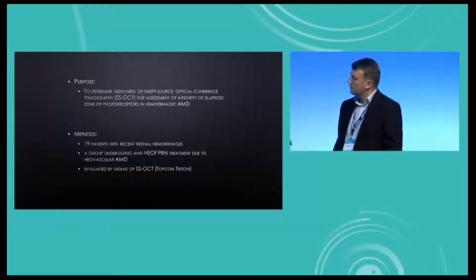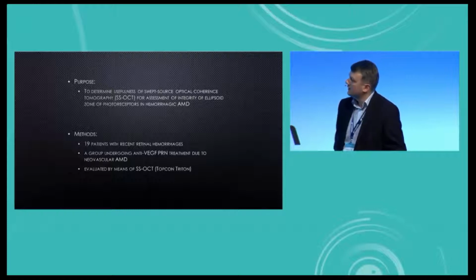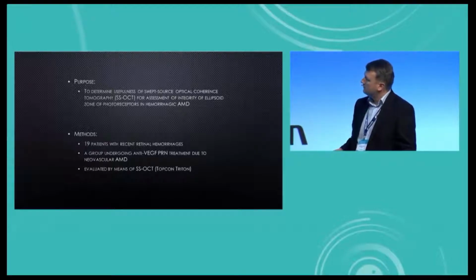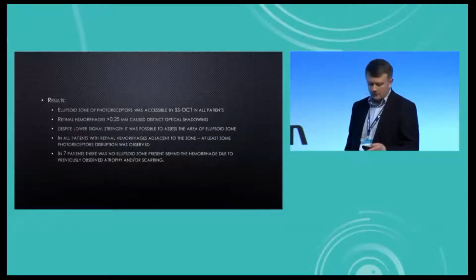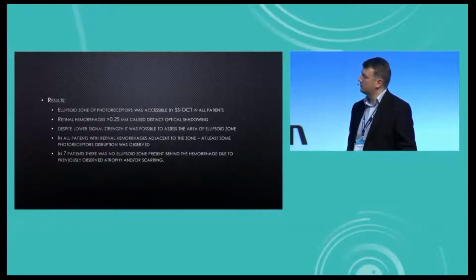So we checked our database for patients treated last year for neovascular macular disease. And we found 19 of them with intraretinal hemorrhages, and that's what we focused on. And we looked for the possibility to determine the integrity of the ellipsoid zone of photoreceptors.